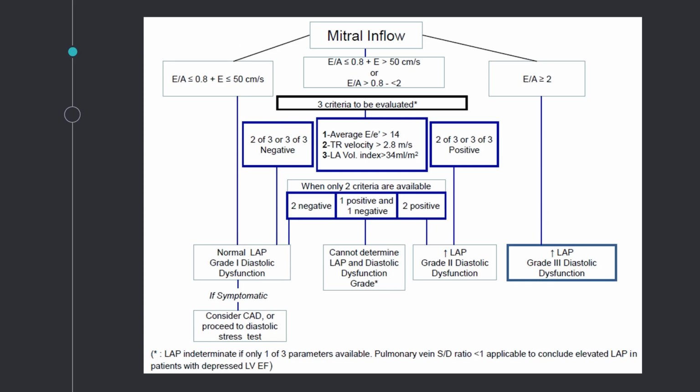So let's see what our colleagues have said, because I think in the cardiology community, people have done one of the two approaches. If you just leave everyone in the indeterminate, then quite a number of your reports is going to be indeterminate diastolic dysfunction, and then the question is, so what? Or you can take another step to go into this. So let's see what my colleagues have to say about this. So Howard or Kim, if you're on, or Geraldine, what do you think?